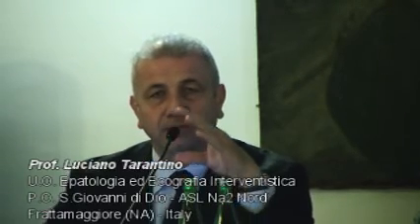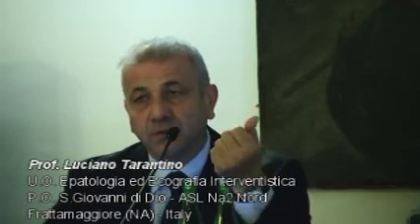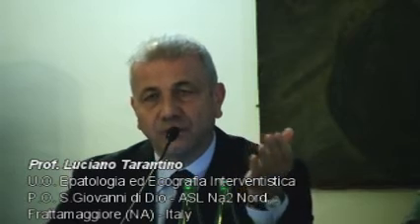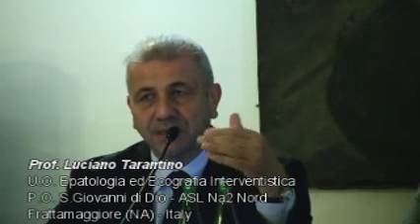I think Orlando pointed out the real role of the CEUS. You told it many times that it's mainly a problem-solving tool, because it's not invasive and it's well tolerated. There are no real contraindications to repeating this examination multiple times.